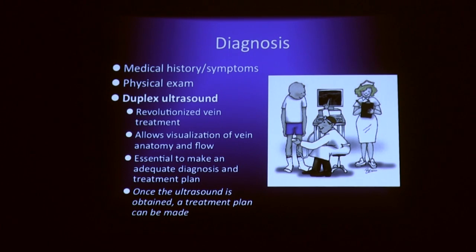So we'll squeeze the leg and push it up, and then we'll see if it stays up. Because in theory, once you push it up, it should stay up, right? The valve should close. It shouldn't come back down. But if it comes back down, and it comes back down for a long time, longer than it should, that means the valves are not functioning properly, and that's how we decide if there's reflux or not.